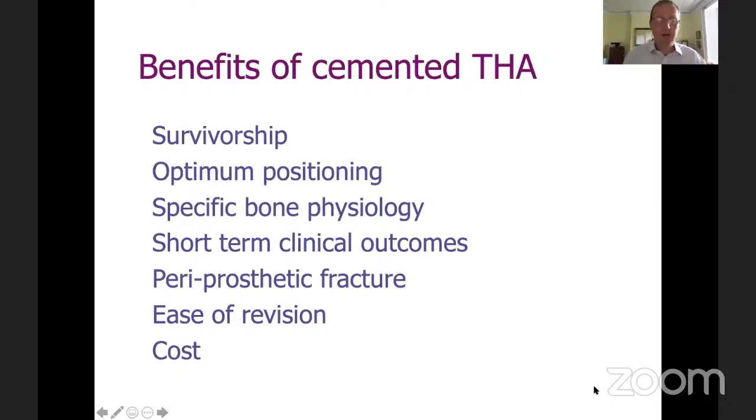They're patient-recorded outcome measures. So you get the benefits in the short term, but you also get the long-term survivorship. Periprosthetic fractures at the time of surgery are far lower in cemented stems than for uncemented stems. And for myself as a revision surgeon now, I've been a consultant for about 13 years, the joy of revising polished tapered stems where I'm revising the acetabulum.